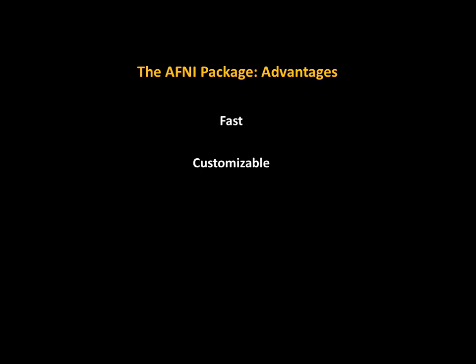Now, they've changed that in recent years. They use something called Uber scripts to generate standardized processing streams. So you select certain parameters, you still have some control, but the actual script that gets generated is from this higher level program. Some people don't like it. I think it's for the best, and we'll see that in a little bit.